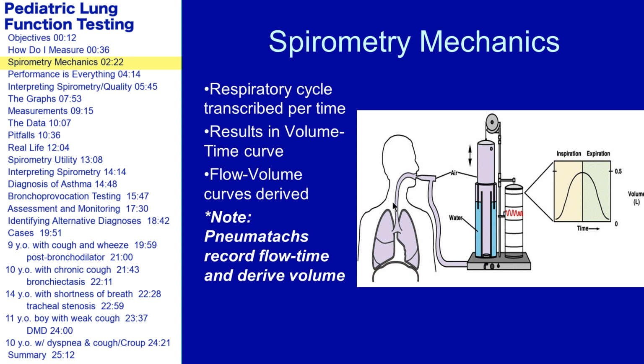And to start with, this diagram highlights the fundamental physiologic measurements that we're doing. And if you look at the figure, the tube that's leading from the person's mouth into this old-fashioned spirometer is about the same size as their trachea, and that's intentional because you don't want to add any airflow limitation by your measurement device.